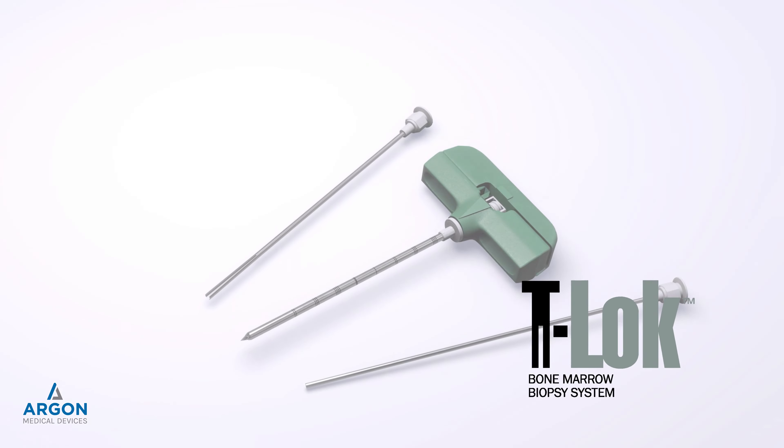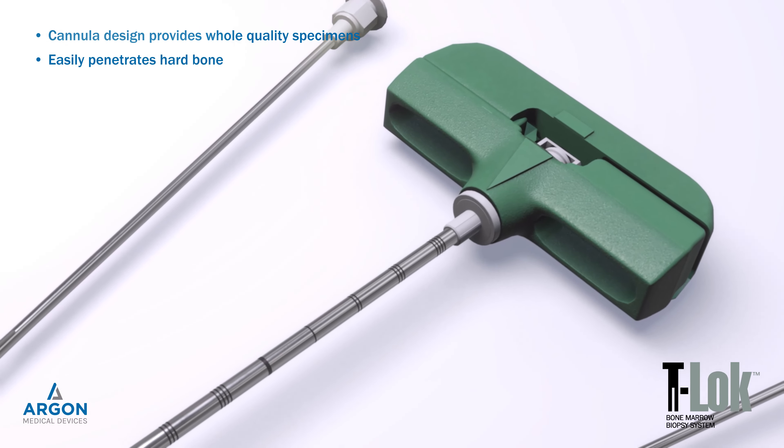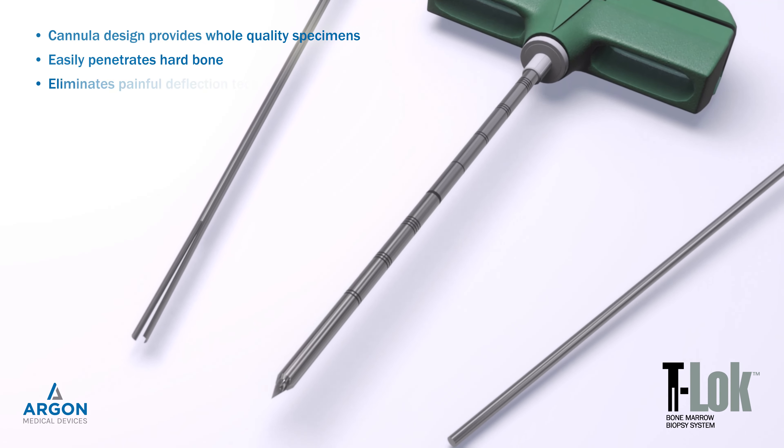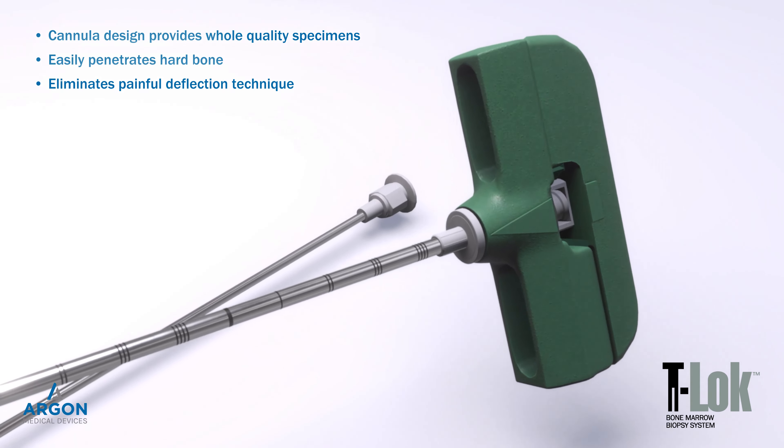Argon Medical Devices T-Lock Bone Marrow Biopsy System — a unique and revolutionary cannula design, providing the precision you need to gather quality bone marrow biopsies without altering the sample.